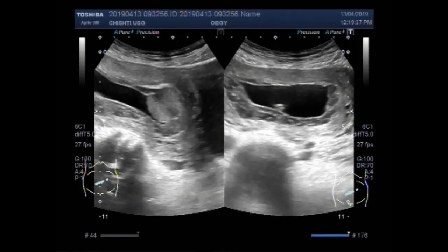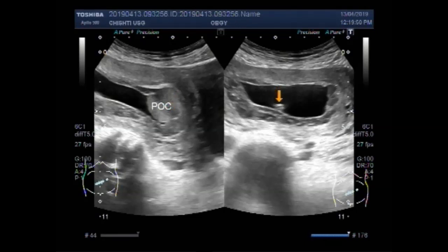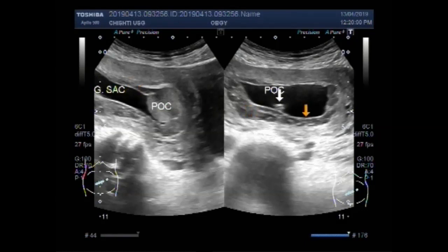This one is a product of conception. This is the polyp. And this one is the product of conception — distinguishing between the two structures visible in the gestation sac.